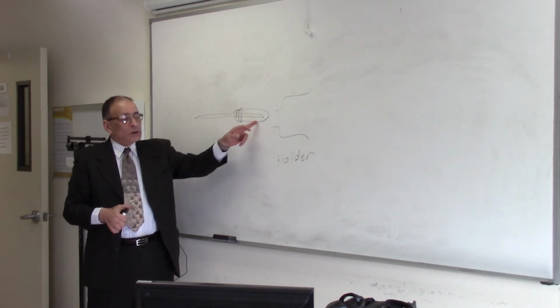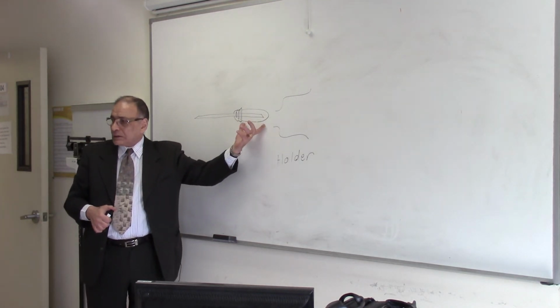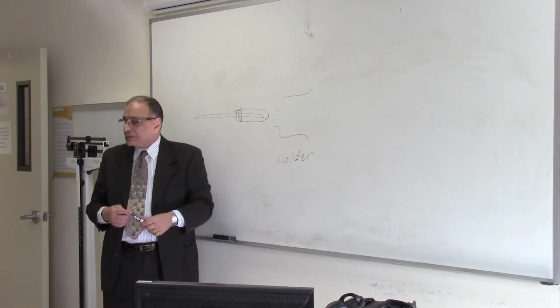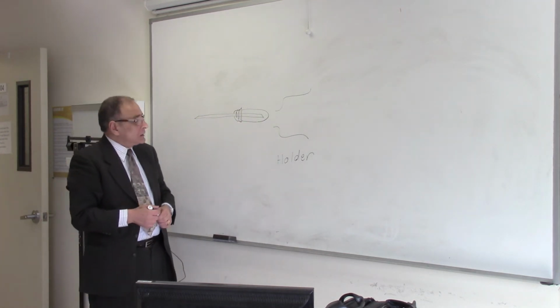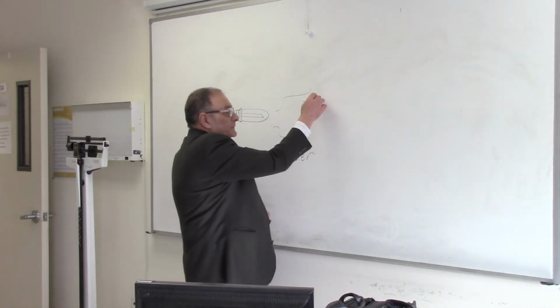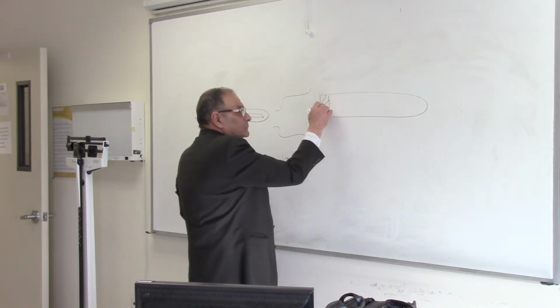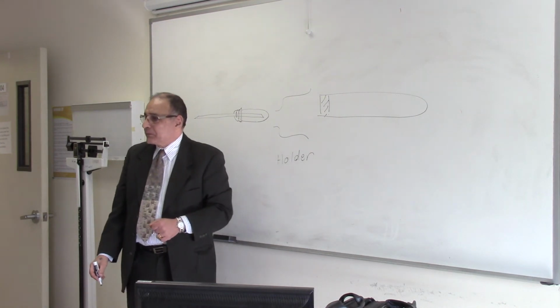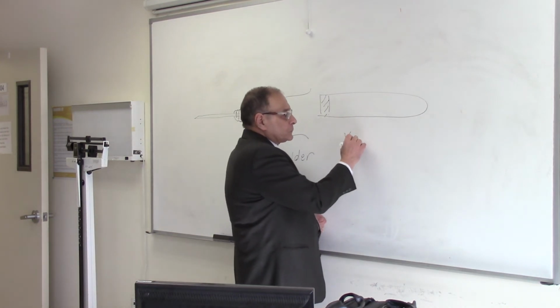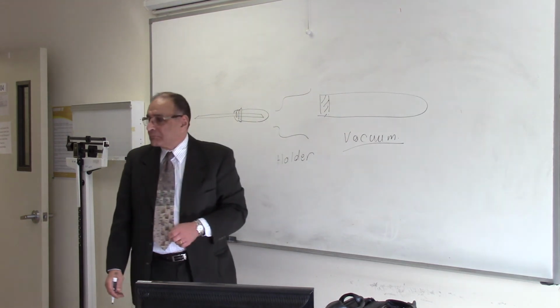The needle has two sharp ends here. One is long and the other side is shorter. The short side here is covered by a rubber sleeve. That is the needle, the needle holder, and the tube. That is the tube. The tube is vacuum, and that is the secret.